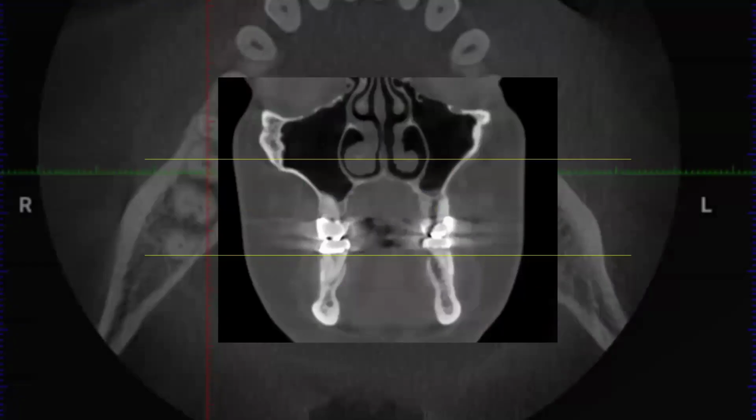And I also want to publish some research on some of the things I've seen. It is recommended to look through one section at a time, so you can divide that horizontally into thirds or into quarters, and then scroll all the way through just looking at that, because it's tough to take in an entire image all at once. If I just look at this top third and then I'm scrolling back and forth, little subtle differences in symmetry are going to stand out to me. And then I go through again, looking in the middle slice and then in the bottom slice.